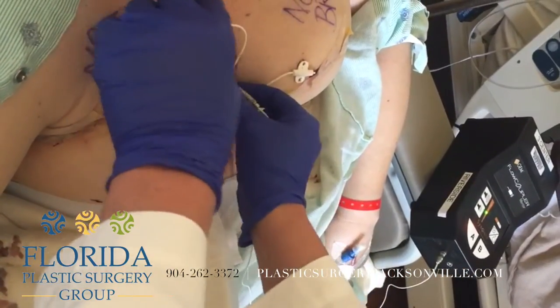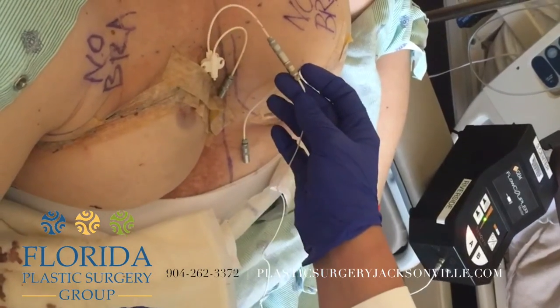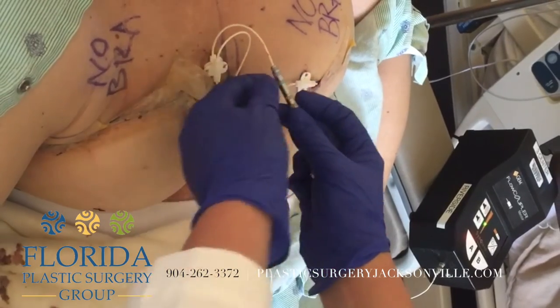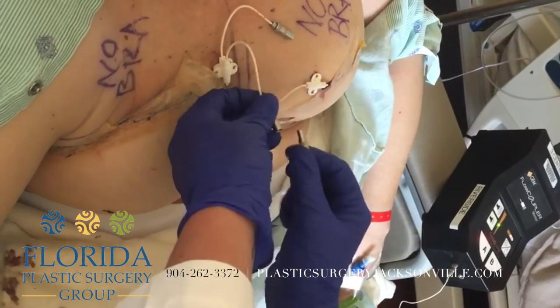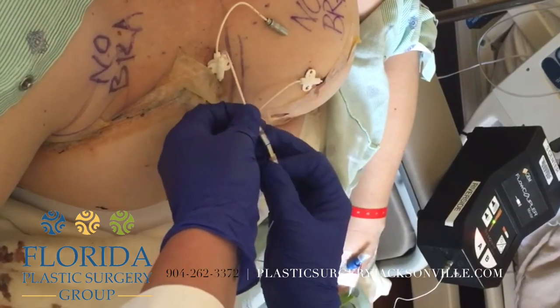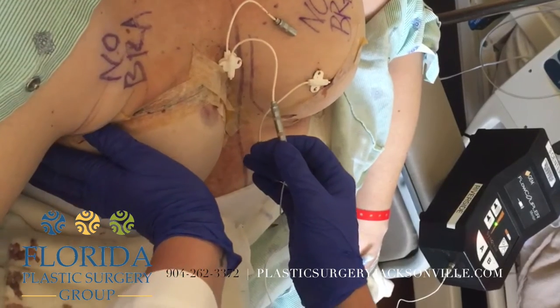We hooked up two veins on her. Those are both normal sounds. If you ever run into a lot of static and you want to hear if the sound changes, you can hook up the vein and give a little bit of pressure on the breast.